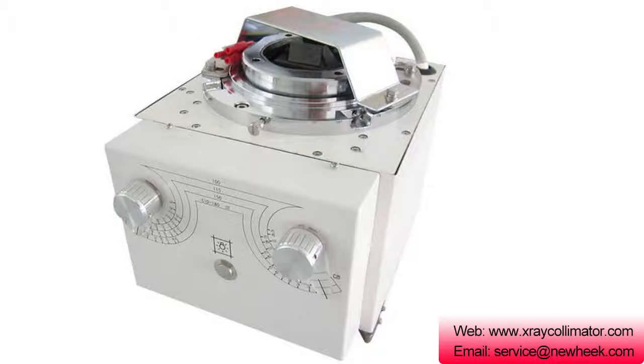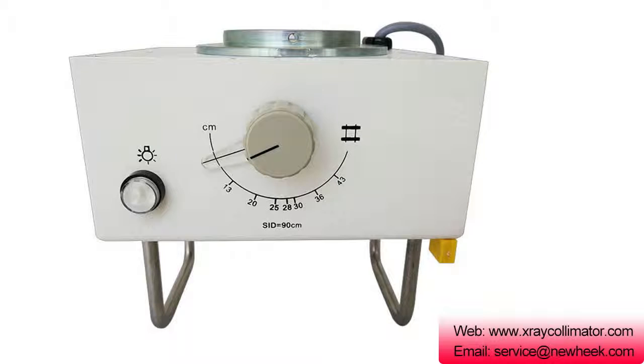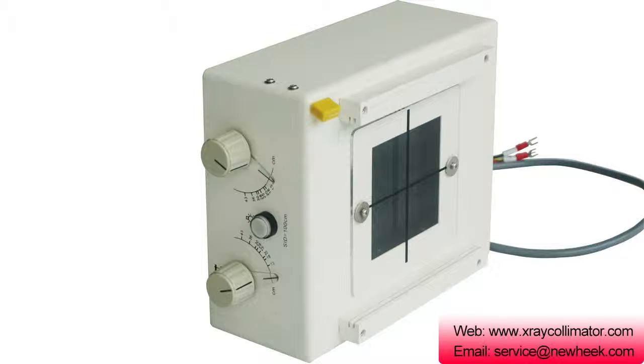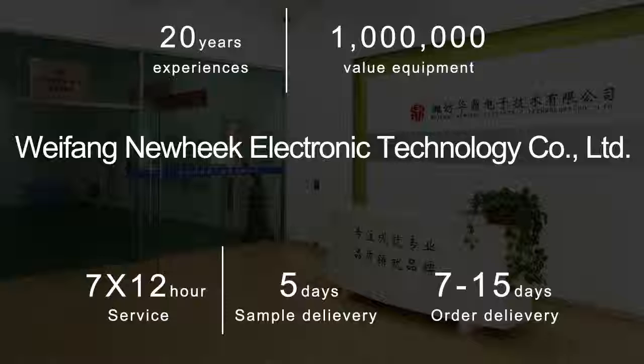In addition to the head collimator, additional head-sized collimators of different sizes are required to be placed under the radiation head in a head stereotactic radiosurgery or stereotactic radiotherapy room using a medical electron linac.